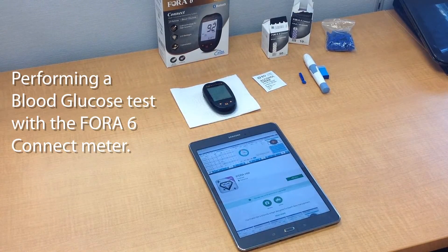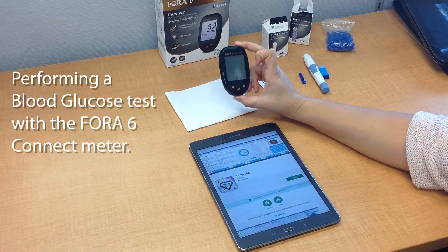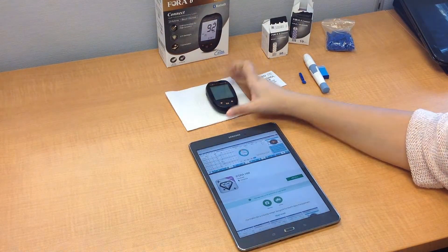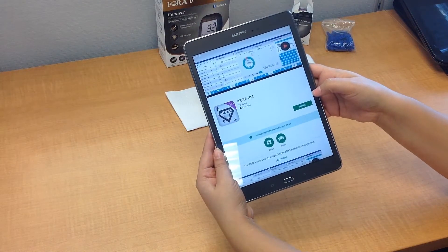Hello! Today we're going to be doing a blood glucose test with the new Fora6Connect blood glucose and blood ketone meter. We're also going to be pairing it and uploading all of our results to the iForaHM app.